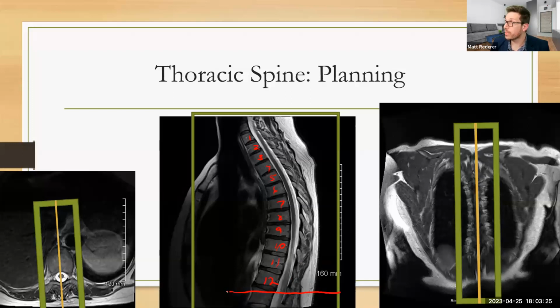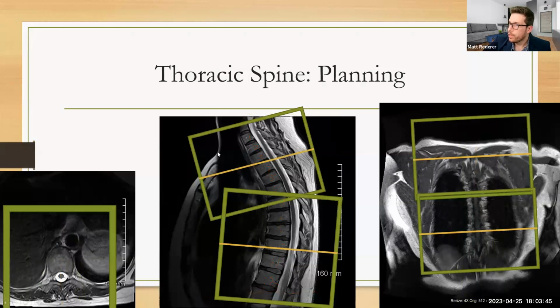Got it. All right, I even got a little bit more than I needed. But this is all I need to cover. I go from transverse process to transverse process. And I get my good sagittal image. For axials, this looks a little confusing. It's like, oh, wait a second, I got 2 boxes, man. What are you doing here?